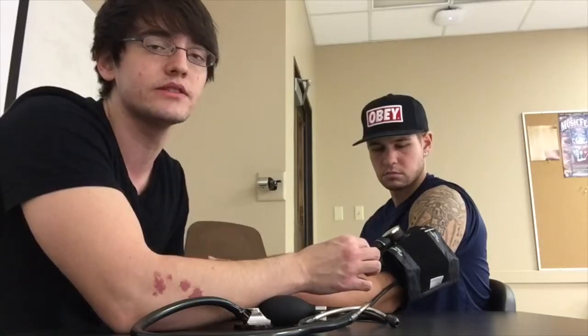I'm going to inflate this to 200 millimeters of mercury, and then I'm going to decrease it by 2 to 5 millimeters of mercury per second. The first sound that I hear, wherever the dial is, that'll be the systolic blood pressure, and the last sound that I hear will be the diastolic blood pressure.